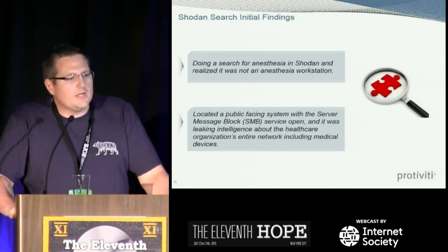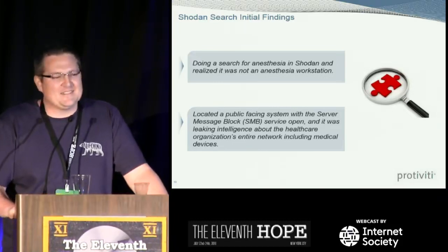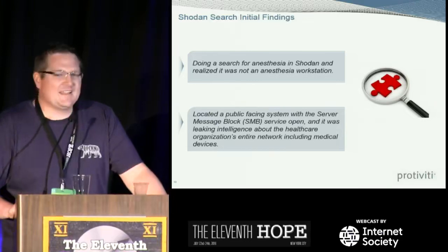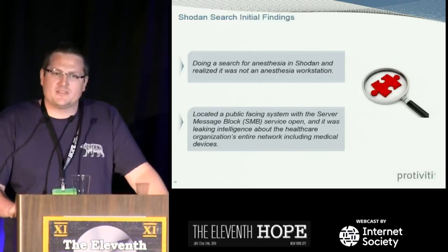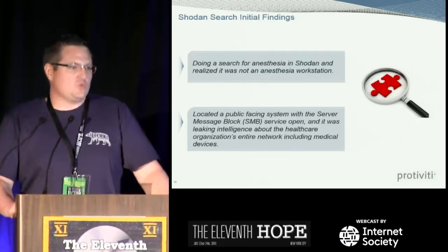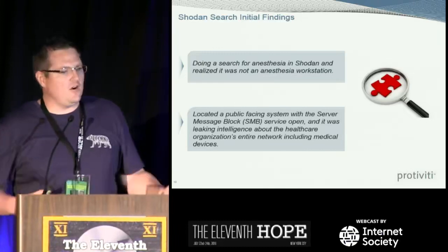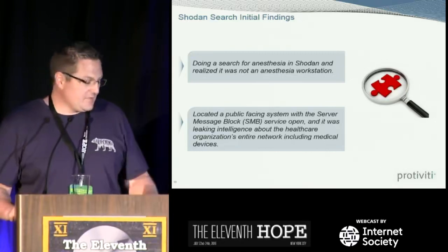What's going on? The only indication that it could have been a medical device is that it was an XP system. But outside of that, I knew this isn't a medical device. What I realized is SMB was actually open on this XP system, and it had an anonymous read to Active Directory. So it was leaking intelligence on all of their internal systems, host names, and identifying information. I'm going to show you some examples of that.